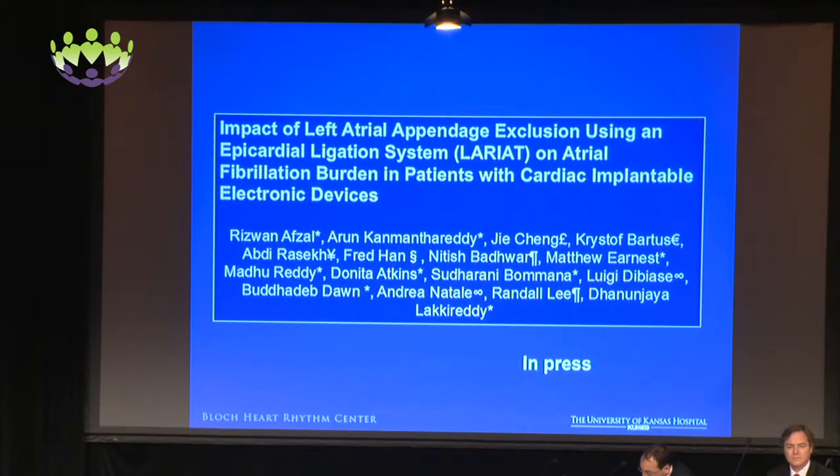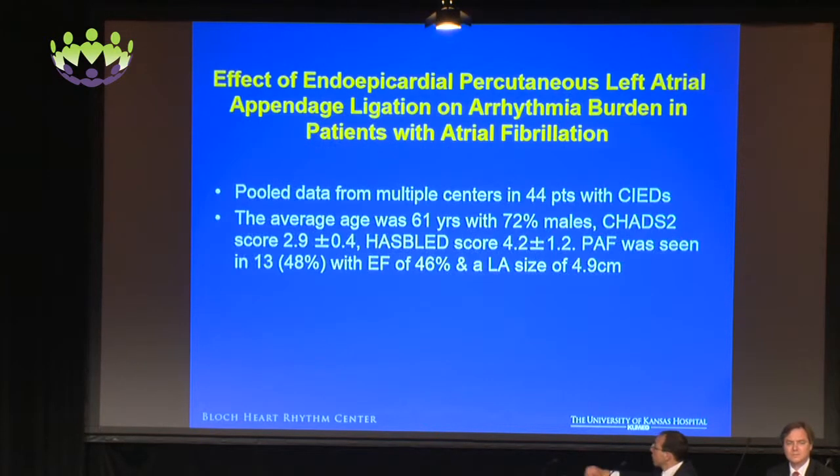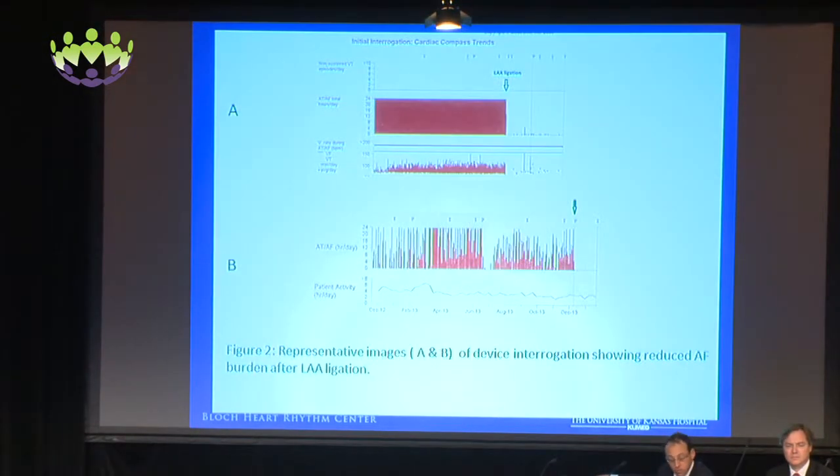So extending that concept, we went back and looked at all our patients who had Lariat devices, patients who had cardiac implantable electronic devices, which includes the pacemakers, ICDs, and CRTDs. And we looked at their arrhythmia burden. This is pooled data from multiple institutions.